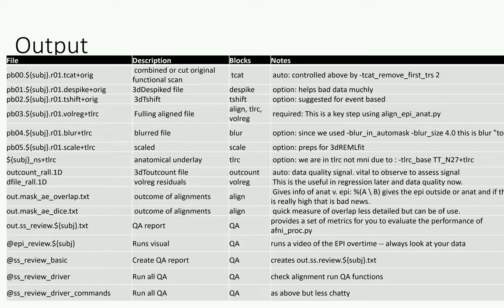You can change that number if it's already been dropped, but if you're using a GE scanner, you'll want to cut those before you start working out your outcount, and inferring things from your dspike and time shift. So the dspike is the next step that was done sequentially on this set of data. The dspike is an optional block, but is very important.